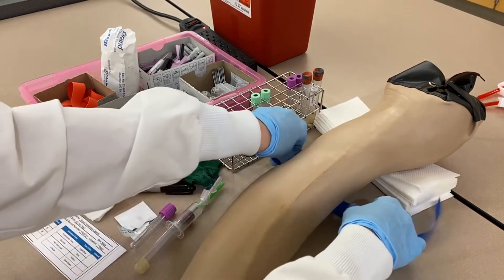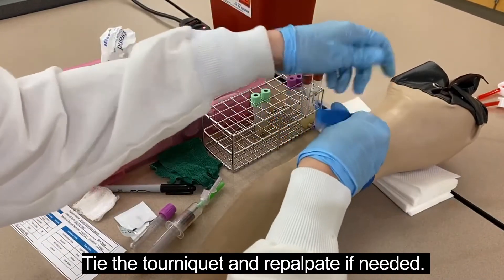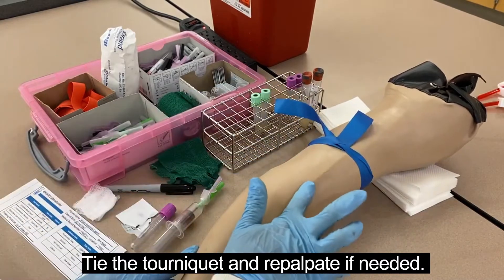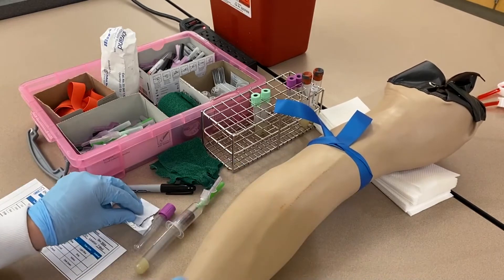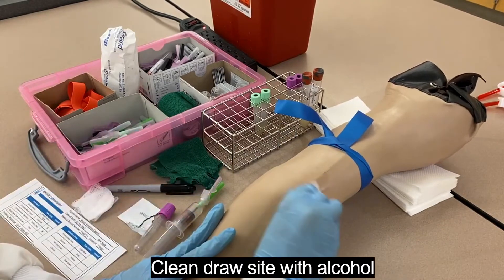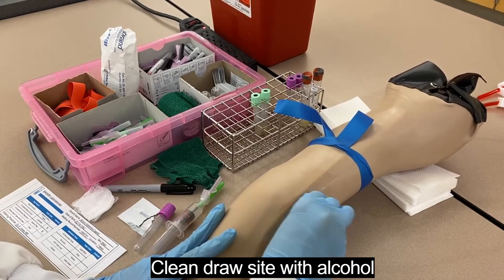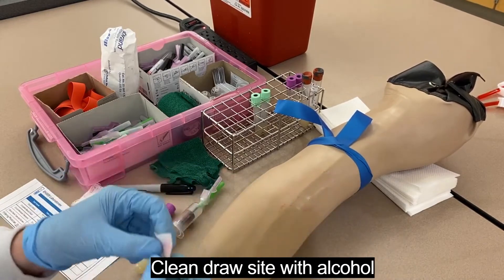I'm going to retie my tourniquet. I can palpate for the vein again just to double-check at this point since I haven't washed it yet — yep, there it is. Have the patient make a fist, keeping it closed until you're in the vein. Then we're going to scrub back and forth with the alcohol. It used to be recommended to use concentric circles moving outward from the puncture site, but research has shown that going back and forth is better for infection control.